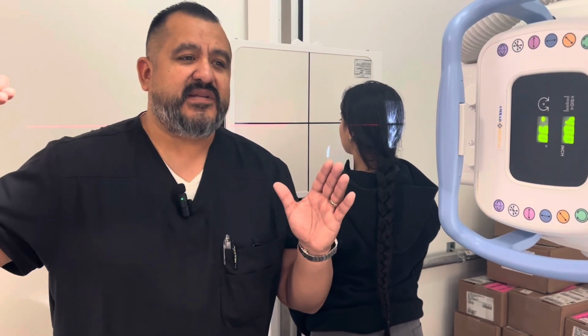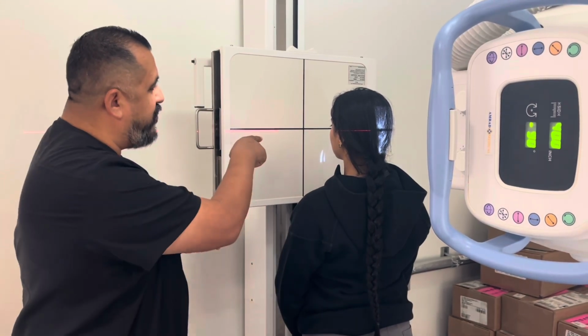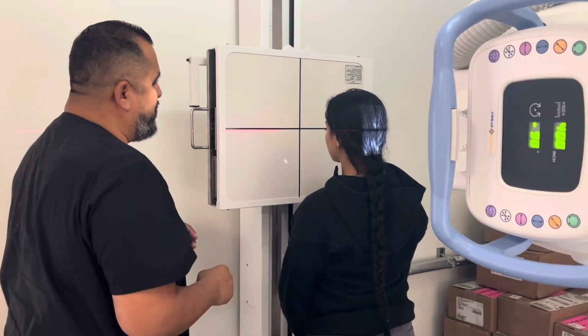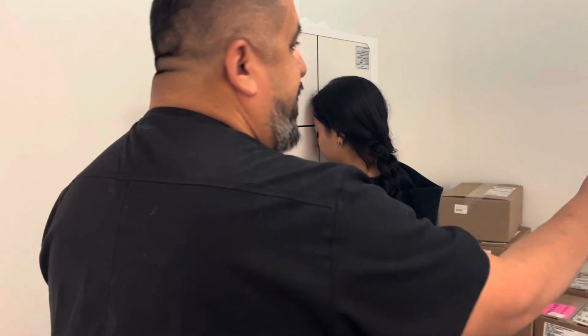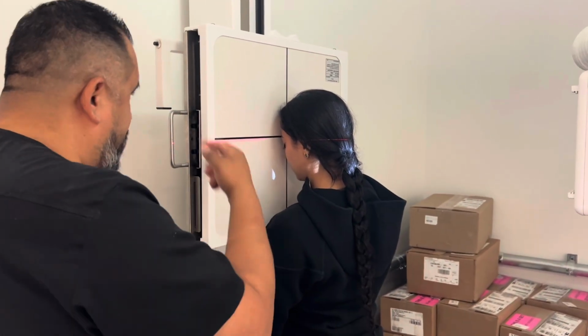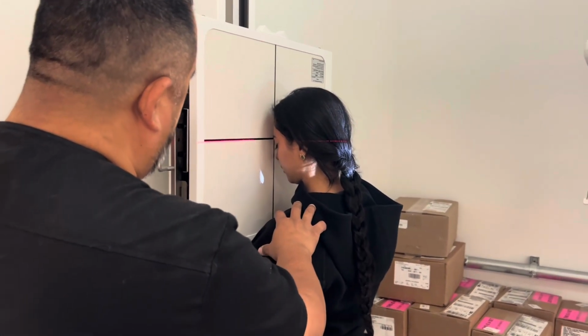Now, if you remember for facial, the Caldwell required us to do a 15-degree caudal angle. But with sinus, the Caldwell is kind of like a PA, but it's going to be a Caldwell with 0-degree angulation. So you're still going to put the forehead and the nose against the board. Let's have you do that here, all the way. Okay, just like that. We're going to exit the nasion, which is right there at the bridge of the nose. I'm just going to lower this a little bit here. Watch your head right there.